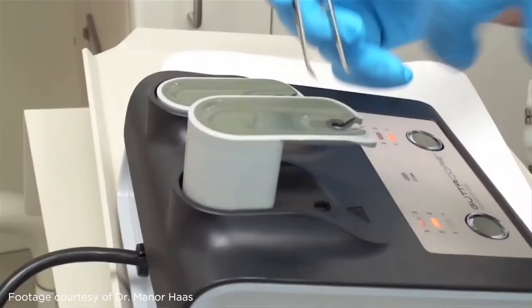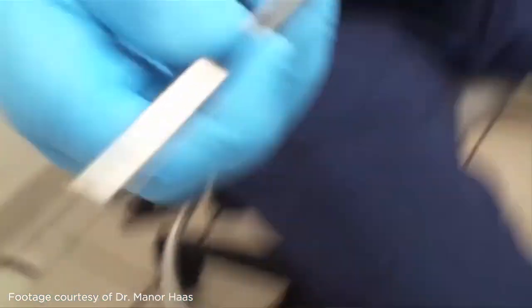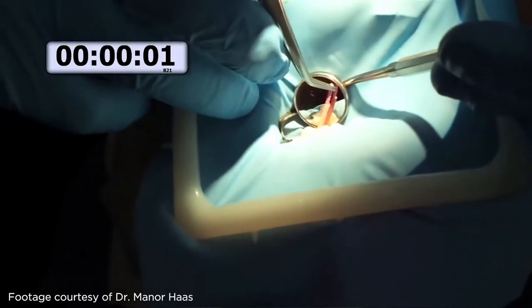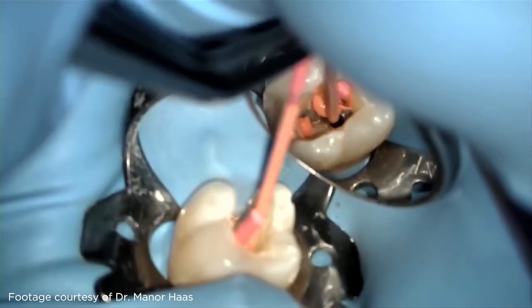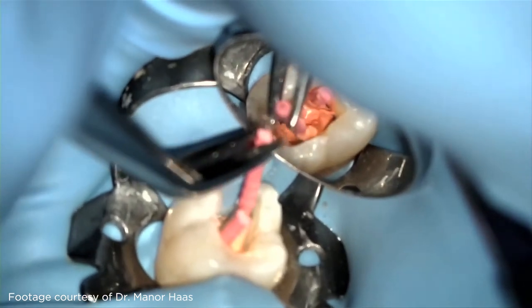My solution is to temper the GuttaCore obturator with standard settings and techniques. When the obturator is tempered, snap off the handle and use a small curved hemostat to place the obturator. Typically, I grasp the obturator with a small hemostat, snap off the handle, and then go right to the tooth.